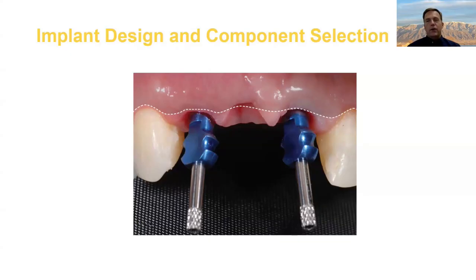Many times I have the serial number and the lot number. So if you have to call in for parts, you can tell the rep you're talking to on the phone, "Well, it's serial number blah," and then they're pretty much guaranteed to get you the right parts. So that's really important. Every once in a while, if you can't get that information, your lab can help you identify implants from an X-ray. It's not the most predictable process in the world, but keep in mind that as a last-ditch effort, that can be a good way to go.